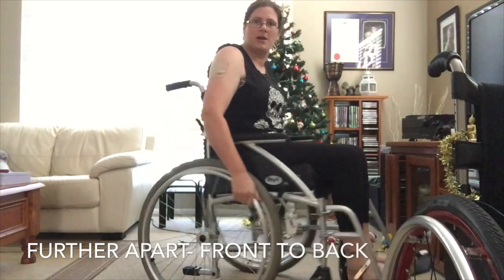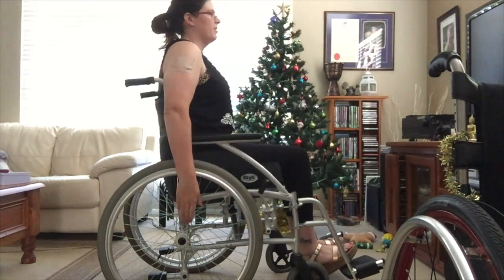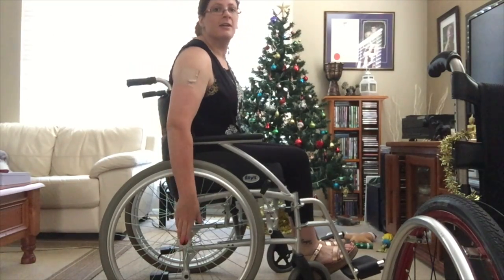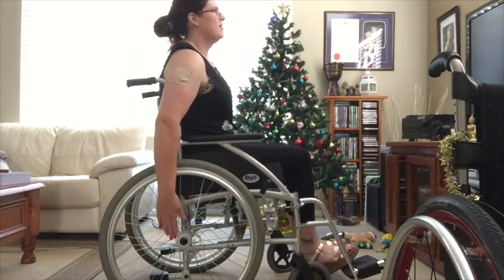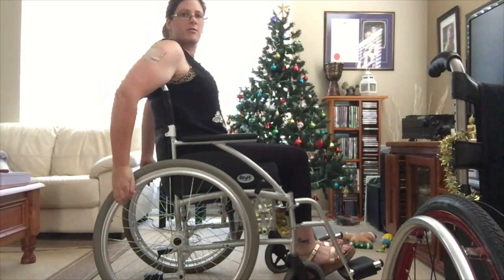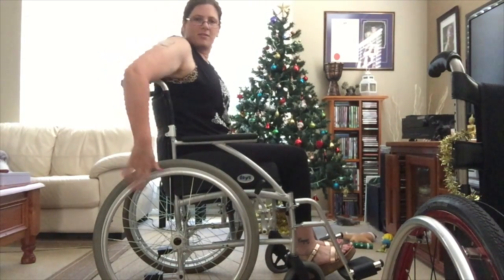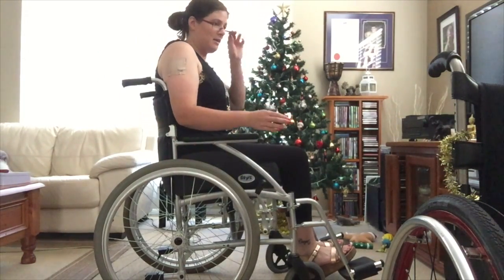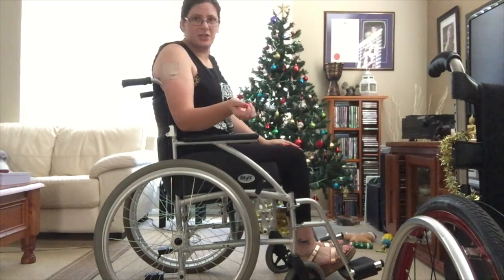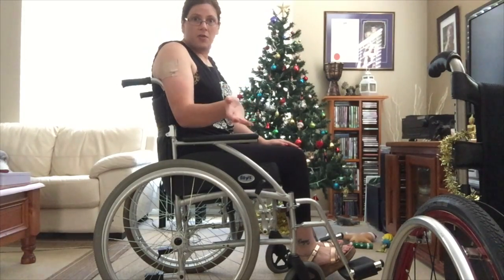The wheels are set further apart — this back wheel is actually set further back. So when I try and push, it's actually a lot harder to get to that 10 o'clock position because of everything that's going on. However, it does mean that the chair is a lot more stable and less likely to tip, which is good for people who aren't very active.